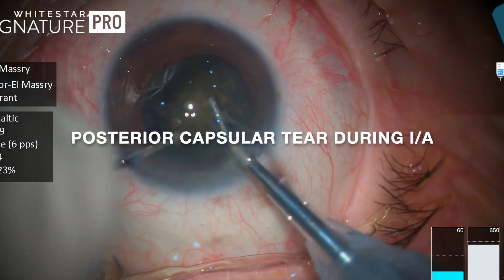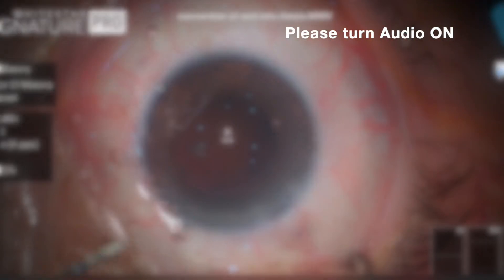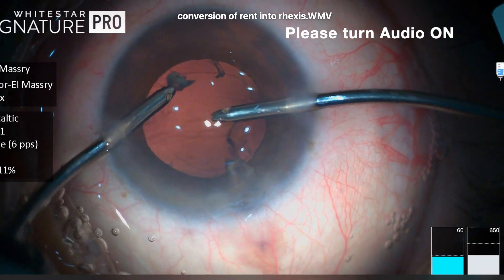Hello everybody. This is a 70-year-old case with a brown nuclear cataract, and after finishing the phacoemulsification, a tear occurred in the posterior capsule during irrigation aspiration.